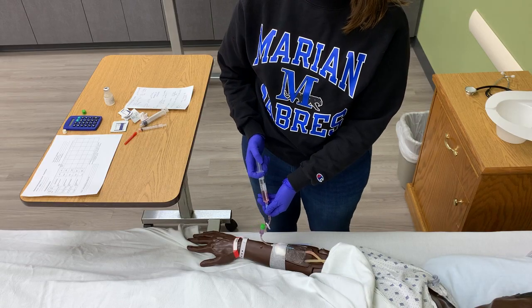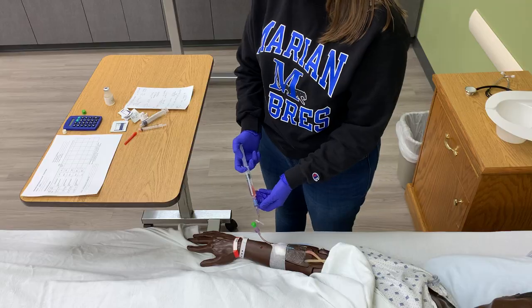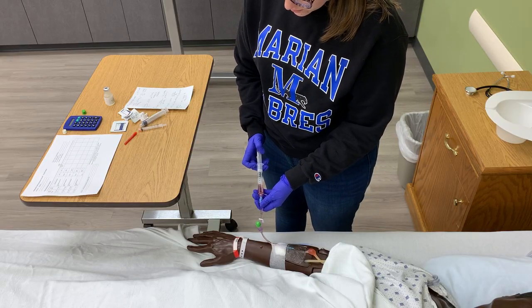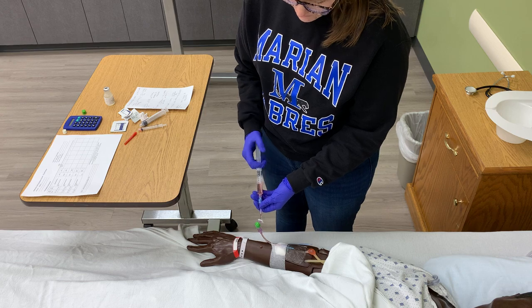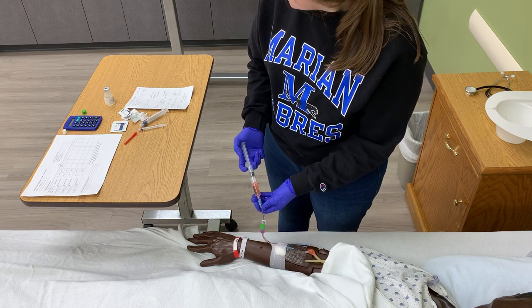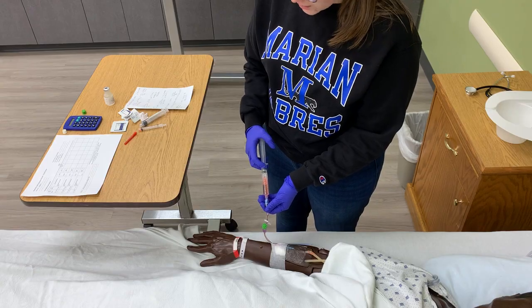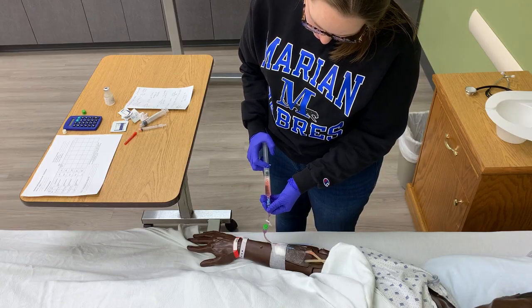All right, so now I have 8.5 mLs left in my syringe, so we're going to give another half ml. Okay. So we're going to give 8 mLs over 1 minute. I have 1 ml every 8 seconds.